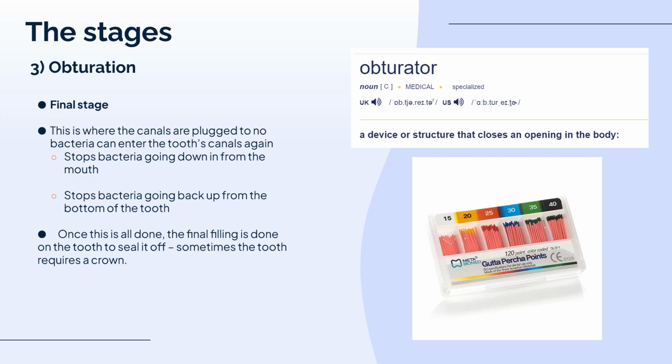Once this is all done, the final filling is done to seal the tooth off. Sometimes the tooth may require a crown. Okay, so this may not be the final step for the appointment today. A lot of the times it is. Again, depends on the dentist. I like to do obturation and crown prep on the same day if I have the time, just to save the patient another visit.